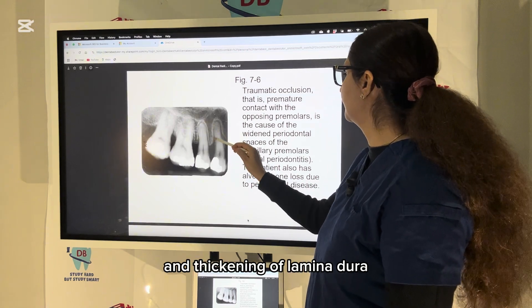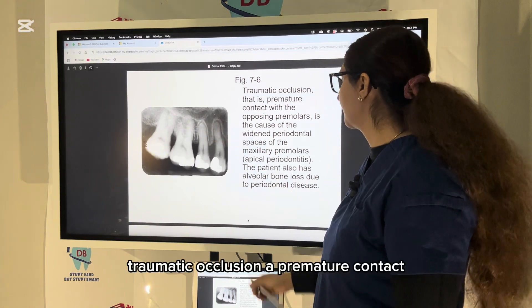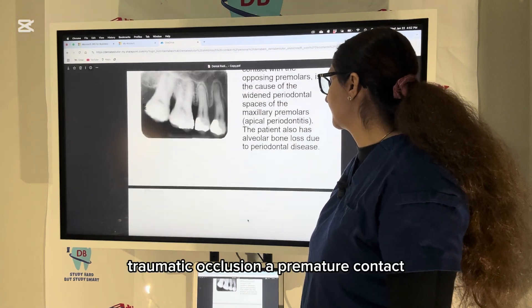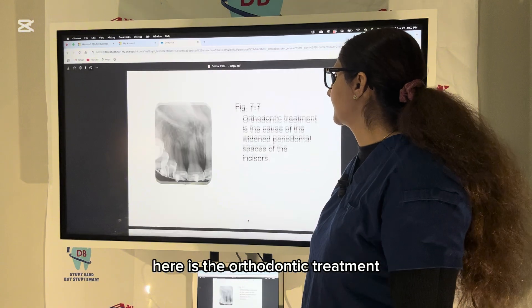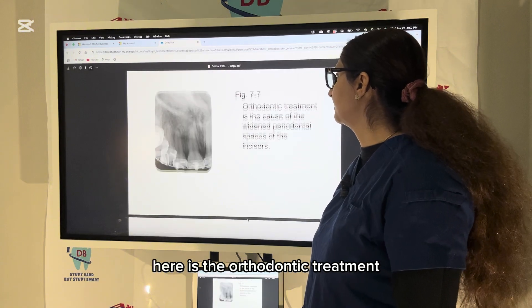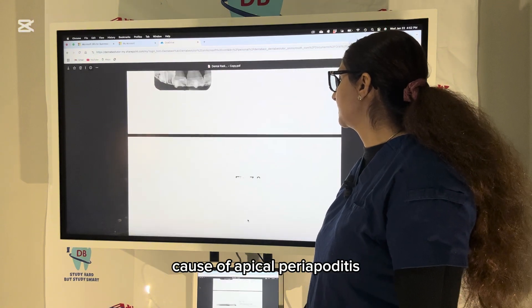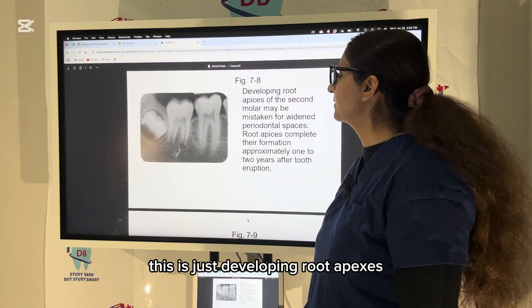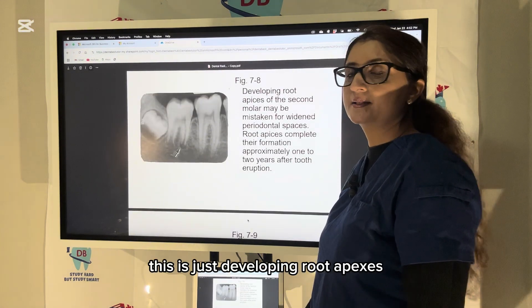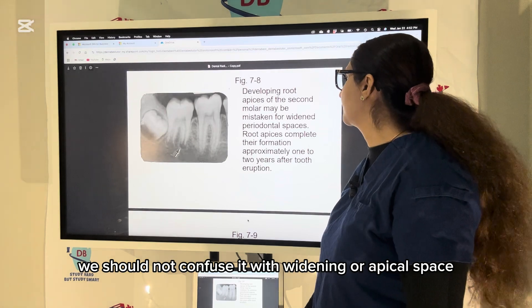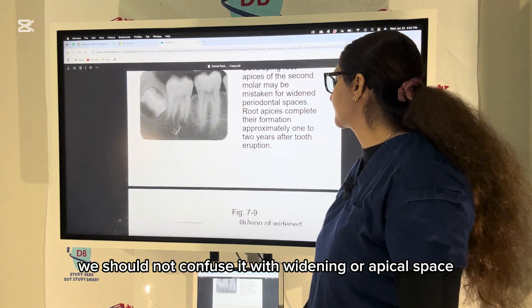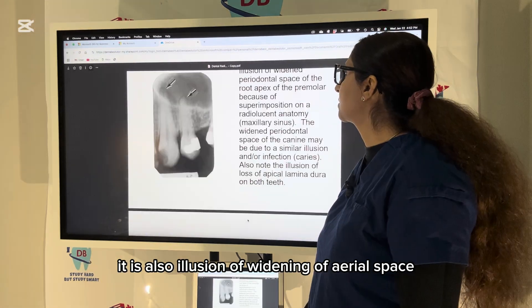Thickening of lamina dura from traumatic occlusion or premature contact. Here is orthodontic treatment as a cause of apical periodontitis. This is just a developing root — we should not confuse it with widening of the periodontal space.